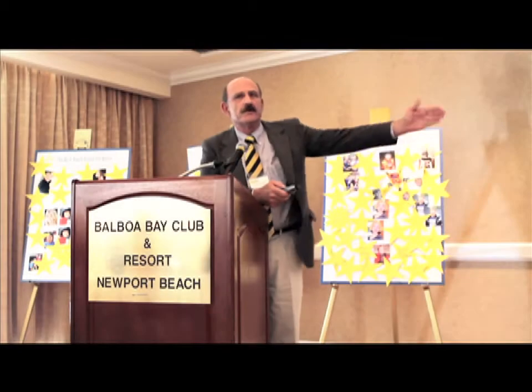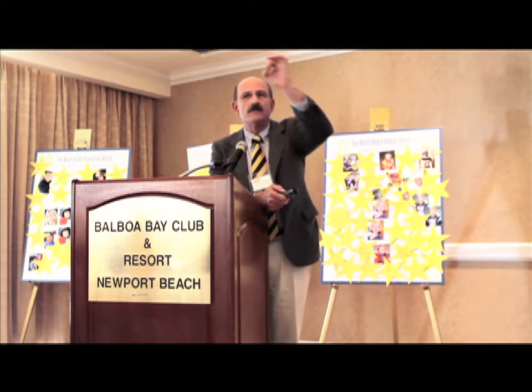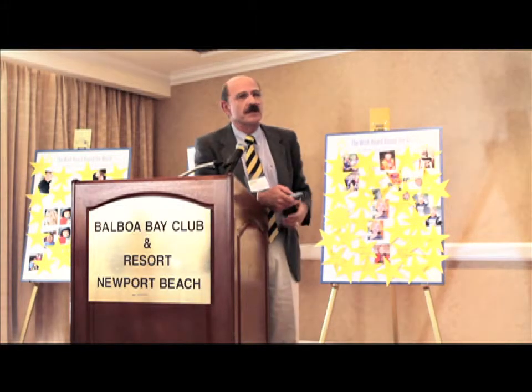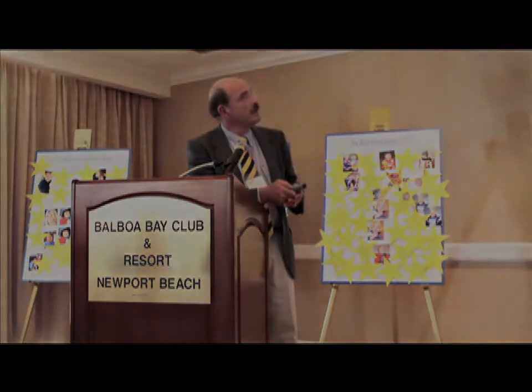What we're going to do is take a series of images. It's called a fly-through, and you're going to start at the surface epithelium. We're going to go into the cornea, and you're going to see these little round dots. They're going to be similar to the black dots that you saw in the histologic section that actually represent the nuclei of the keratocytes. If this movie plays, hopefully.